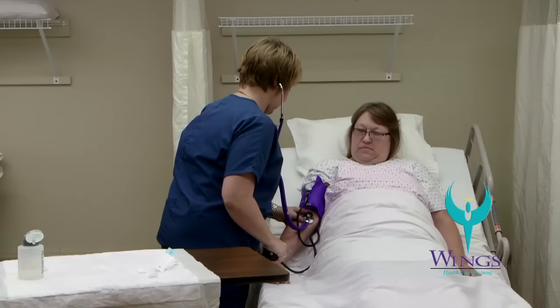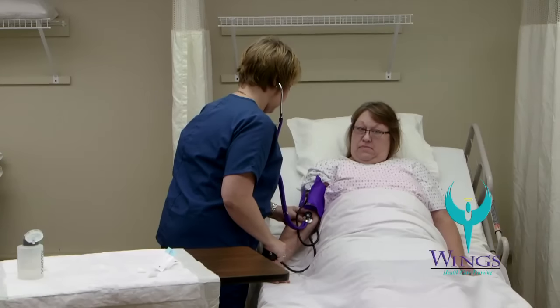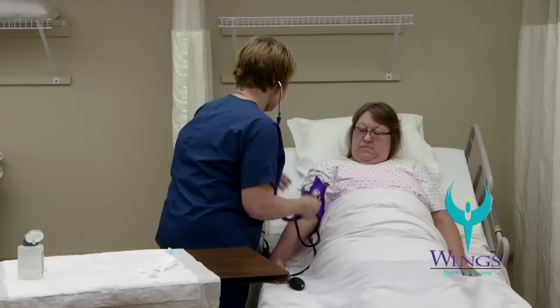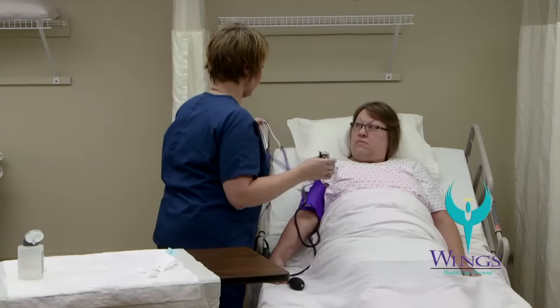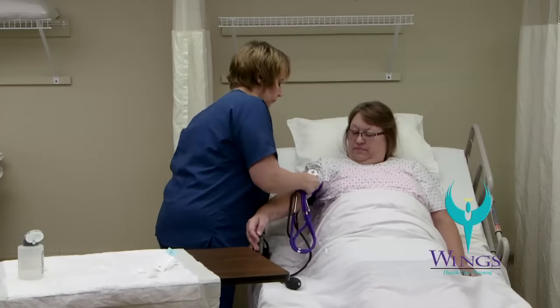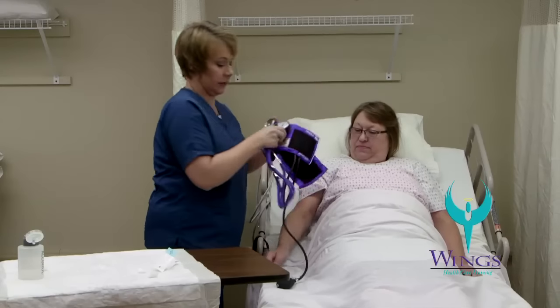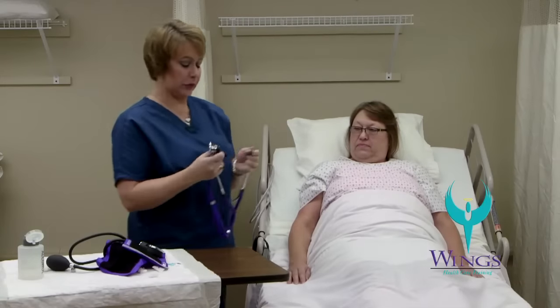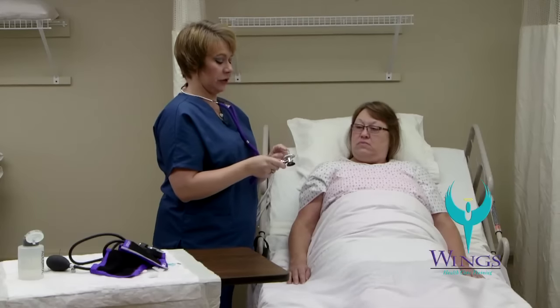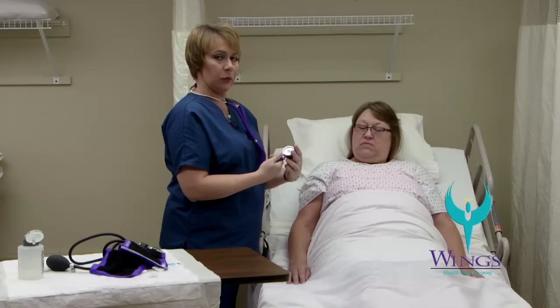I slowly release the air from the blood pressure cuff. I'm going to remove the blood pressure cuff from her arm and set it aside. Before using the stethoscope, it's always a good idea to make sure that the ear pieces are pointed forward towards your nose and that you check to make sure that the head of the stethoscope is on the right side.